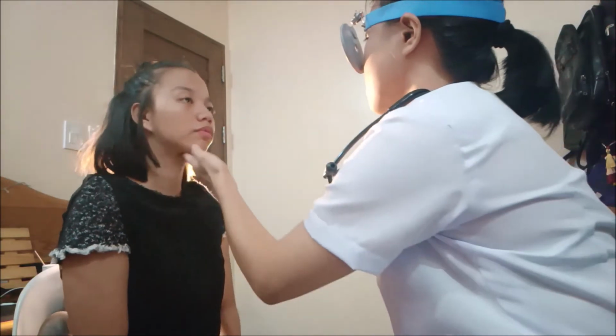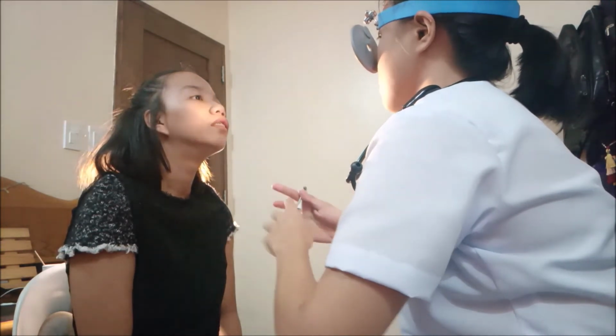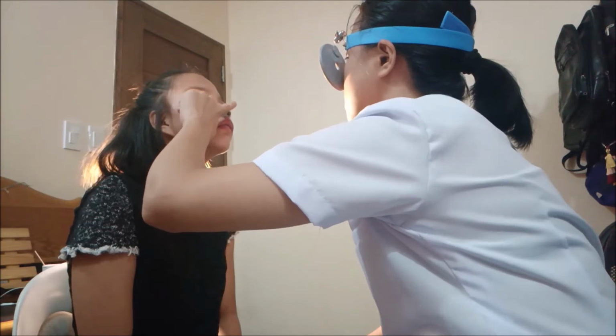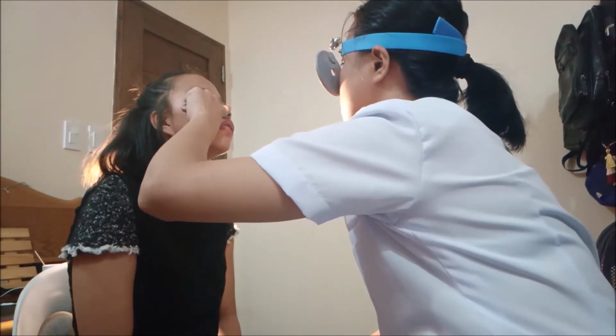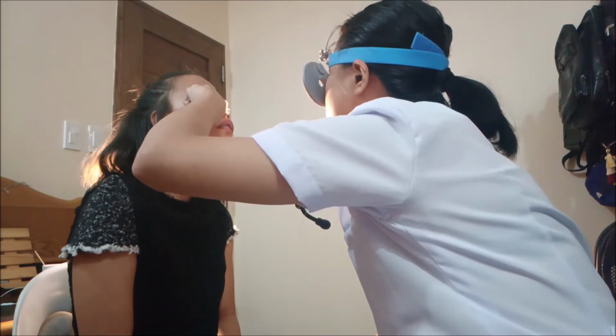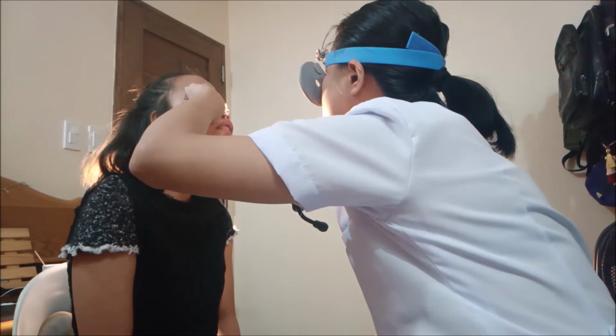We use anterior rhinoscopy to evaluate the nasal vestibule and anterior nasal cavity. With this, you will be needing a light source, head mirror, and nasal speculum. Instruct the patient to angle his or her head in a sniffing position. Gently insert the nasal speculum inside the nostrils of the patient. Hold it properly while bracing your index finger.